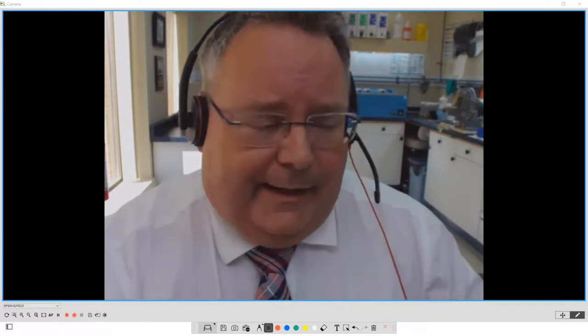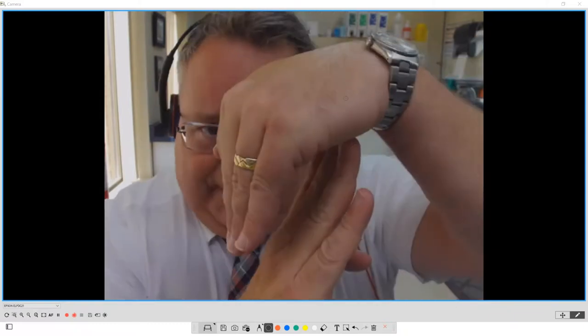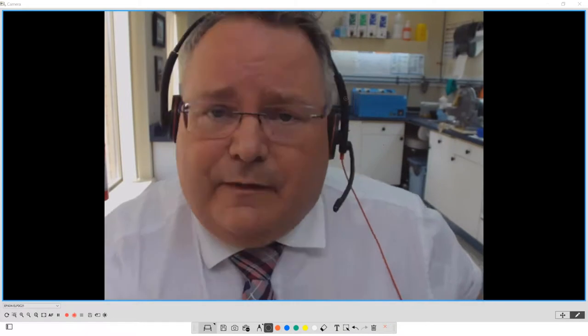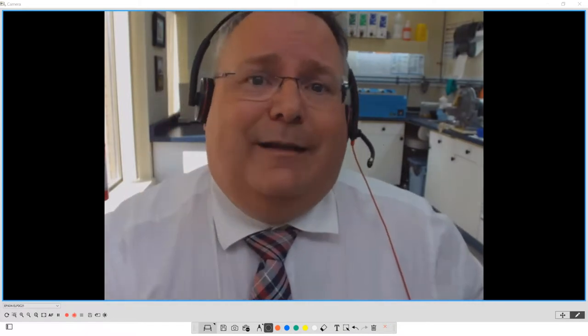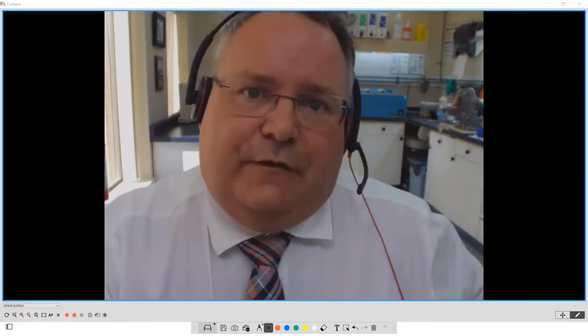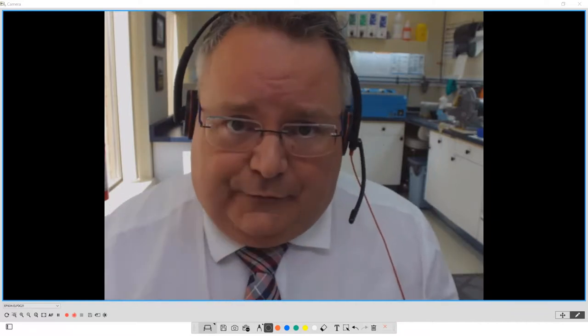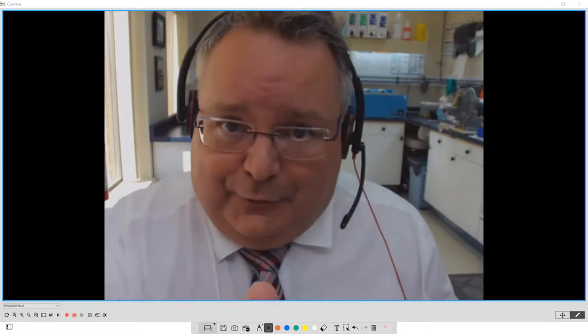And now here I am challenging myself to do things different, that I can build denture cases with 5 millimeters of overbite on them and they work and they're in the mouth functioning because I've put freedom in it and I've followed the chew cycle of a patient. And that's what I wanted to demonstrate here. You challenge yourself. Yes, you can. Freedom is good. Woot, woot.